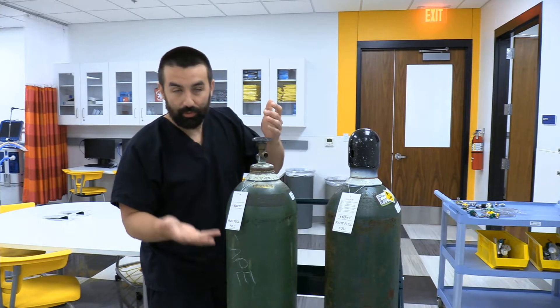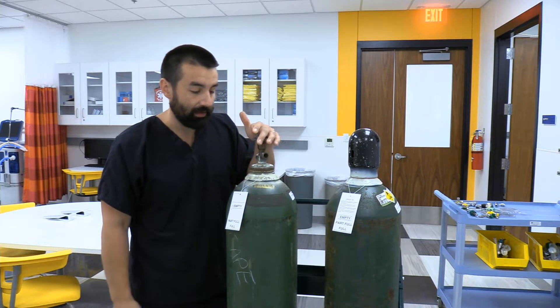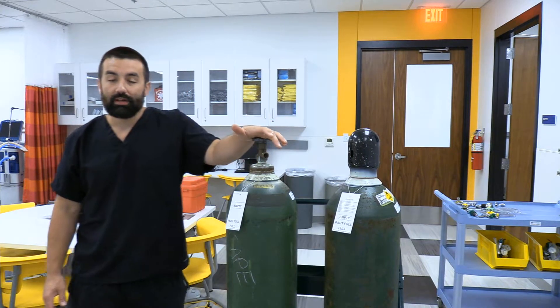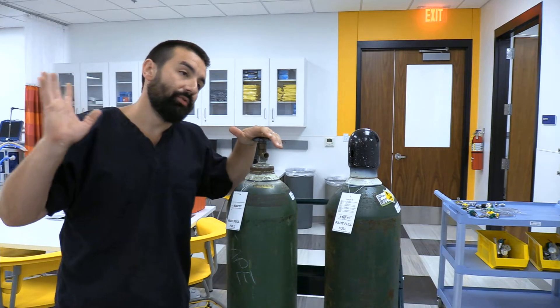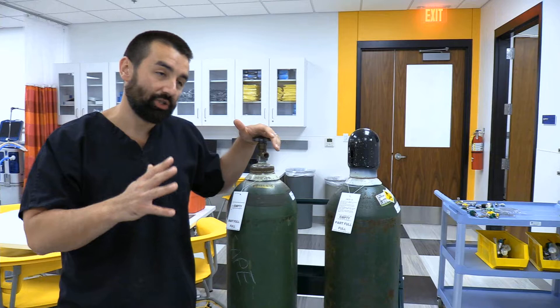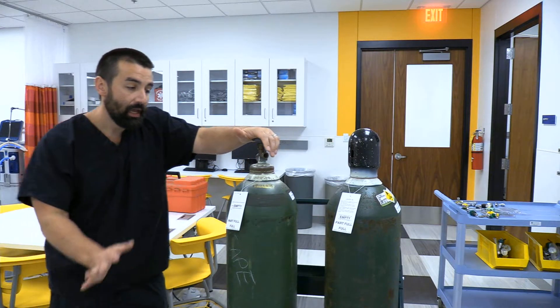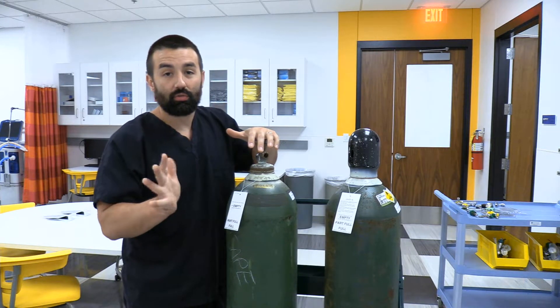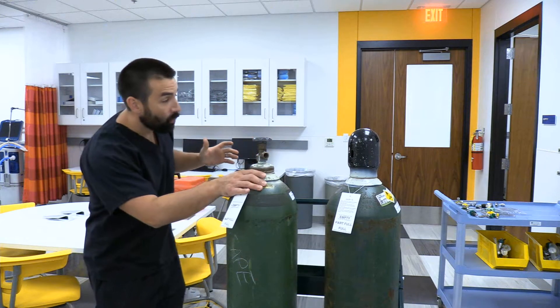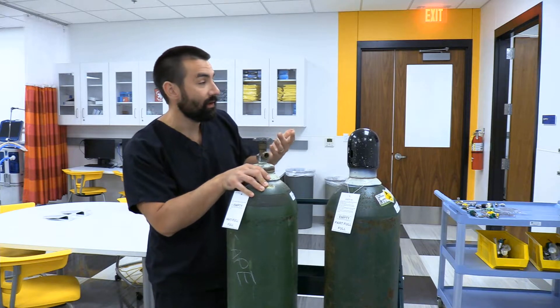The first thing we do when hooking up a pressure reducing valve or regulator is crack the cylinder to clear any debris. People scoff at this, but if you have debris in there moving at high velocity through metal, you could get electrostatic discharge. While oxygen is not flammable, it greatly supports combustion, and we don't want anything like that happening.